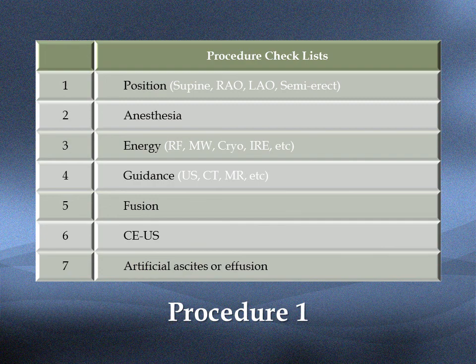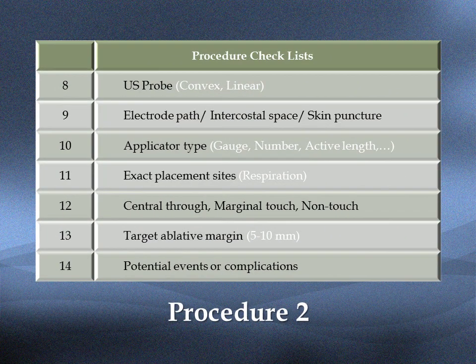Patient position, anesthesia, energy source, guidance, fusion, contrast-enhanced ultrasound, artificial ascites or effusion. What kind of ultrasound probe?